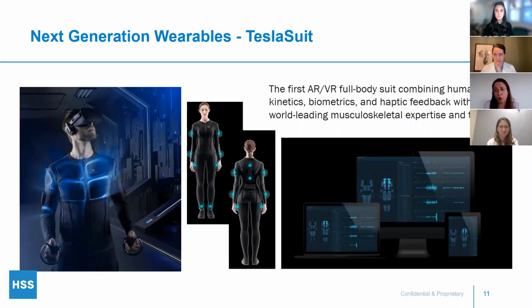that can provide haptic feedback to your body and train you on how to move, with all kinds of sensations, so that patients, for instance, through their recovery, can be guided on how to move. This could have potential applications in muscle atrophy or anything where we need to retrain our muscles and our body on how to move.